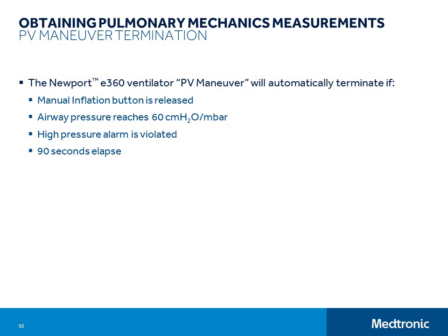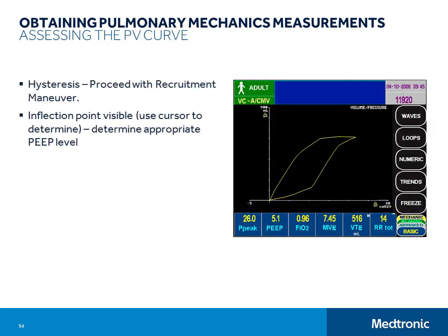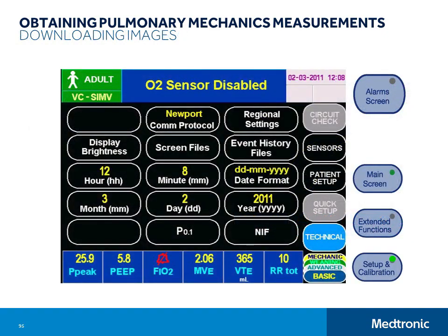Use the Adjustment knob to set the cursor to the inflection point, then touch Save to store the screen image. When you assess the PV curve, you will likely look at how wide or big the difference is between the inspiratory and expiratory limbs — this is called hysteresis, and is used for predicting the potential success of a recruitment maneuver. The other aspect of this curve that you may find helpful is the lower inflection point, which can be valuable for determining the appropriate PEEP level for maximizing volume delivery with the least injury. After you have saved the screen to memory, it is very simple to download the screen image of the curve to a flash drive. Press the Setup and Calibration button on the control panel, touch the Technical button on the GUI, and then touch the Screen Files button. A scrollable table of the corresponding saved files will appear. Install a USB flash drive version 2.0 or later into the USB port on the back of the ventilator, then using the Adjustment knob, highlight the file you want to download and touch the Download button. Here are some reference articles that you may find useful in your study of pulmonary mechanics.